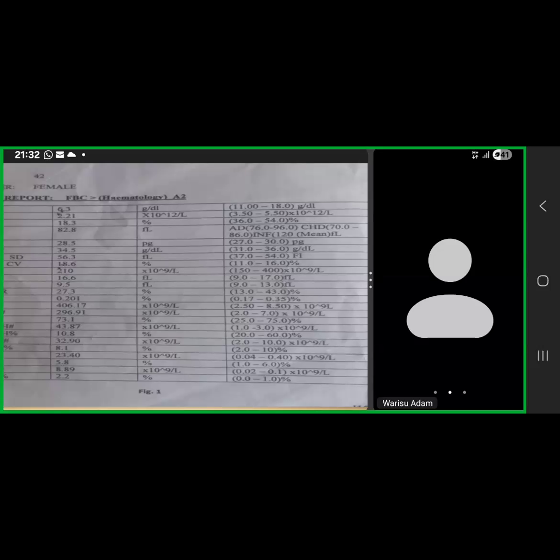We would have finished by now. Only the person, instead of saying we'll review a peripheral blood smear and see so and so, was talking about BCR-ABL transcripts. So I asked whether they have that in their facility. Then he said he will outsource it. I said we are doing what we can. We talked about our screening tests. That's what we want to do. Full blood count.